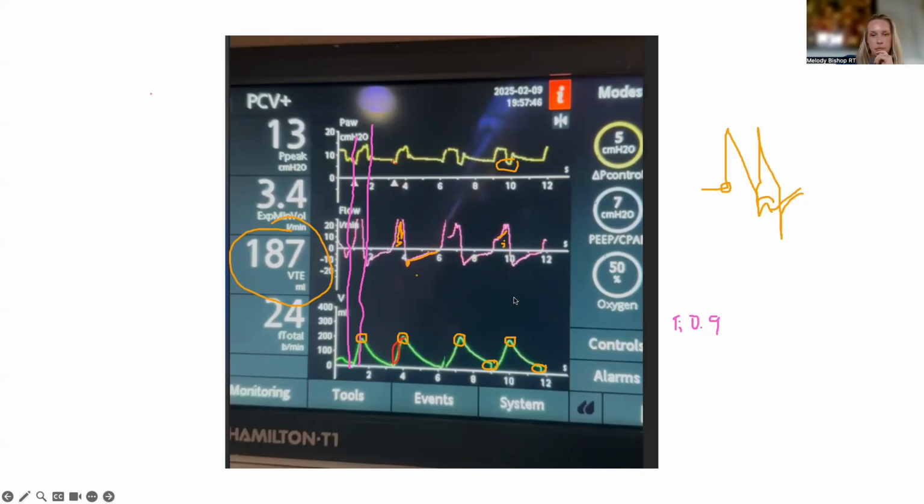I would need to ask Melody, what is the patient's situation? Are they sedated? Are they paralyzed? Are they awake and breathing? Because with reverse trigger, there's a pattern, and the patient should be sedated heavily. It comes up when you think the RASS is -5 but for some reason they're double triggering. Then you look at the pattern and you're like, wow, this isn't a double trigger, it's a reverse trigger.